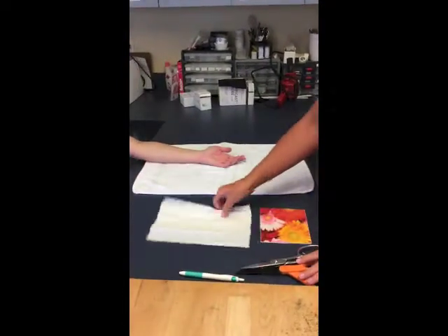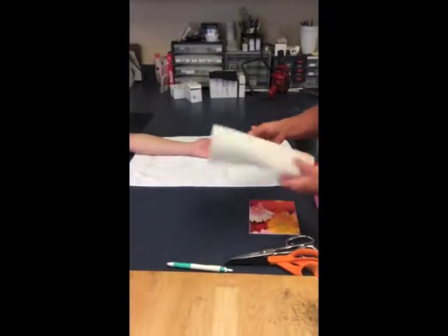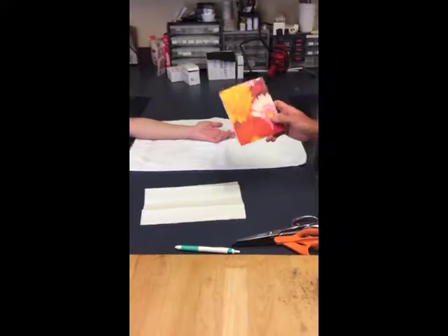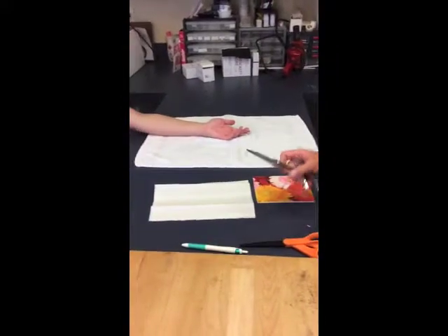Materials needed: I'm going to use just a paper towel to make a pattern for myself, the thermoplastic material, and scissors for now.